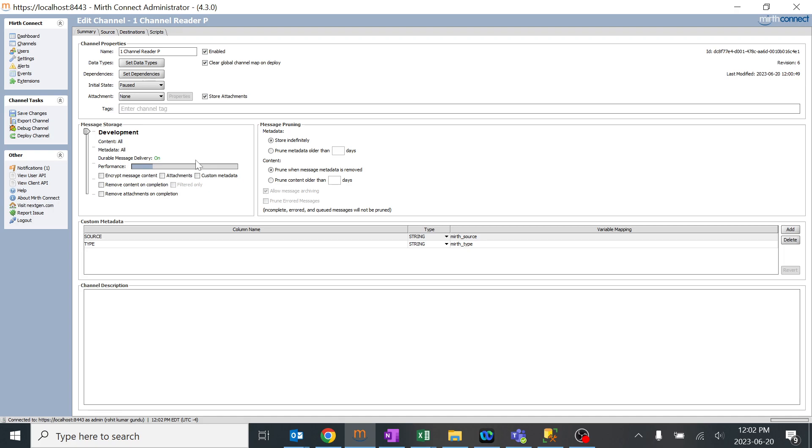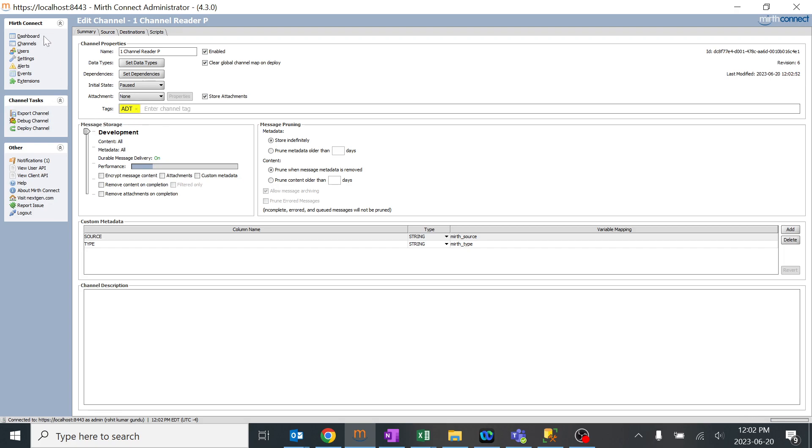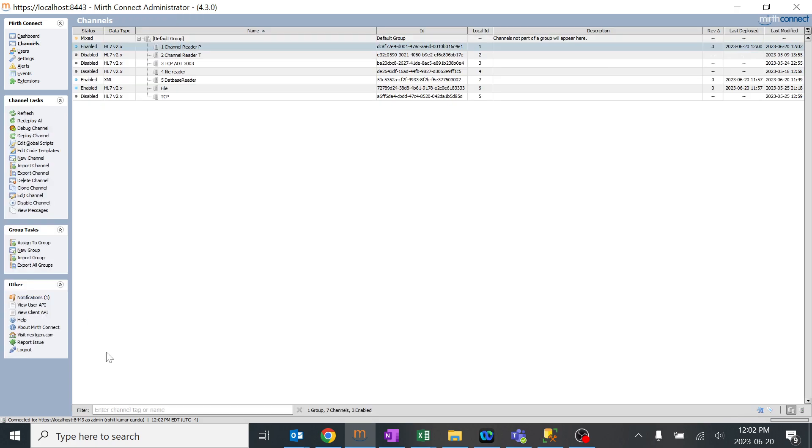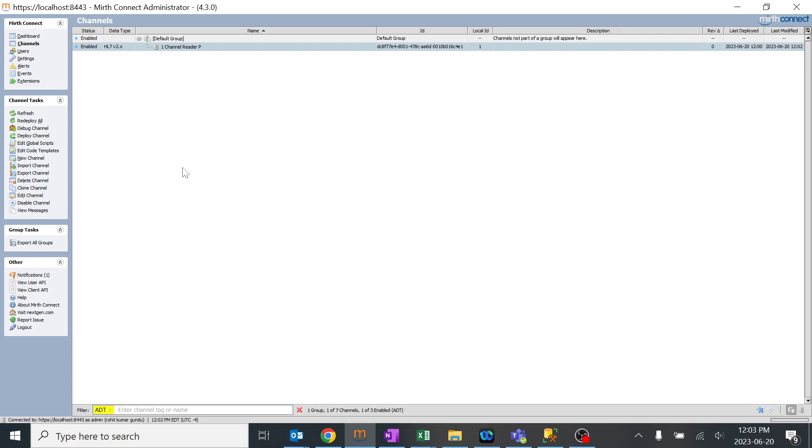We are also going to learn about tags over here. You can see there's an option known as tags in the summary part. I just want to give something like ADT and click enter, and you can save it. When you go back to channels, I just want to search a few of the channels which have been tagged as ADT. I'll just type ADT and you got an option here. I'll just click enter. Yep, this is the one channel which we have tagged as ADT.